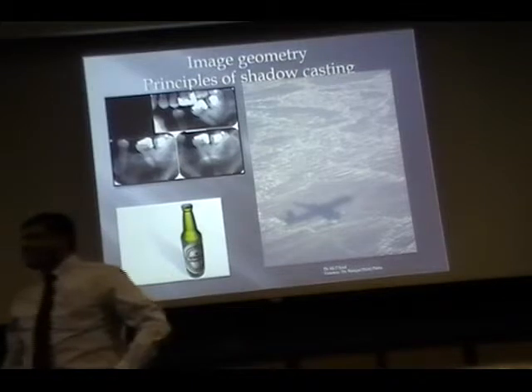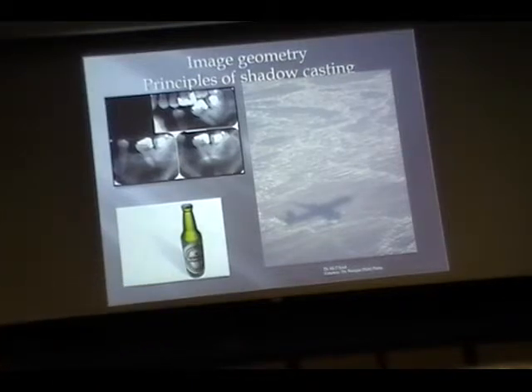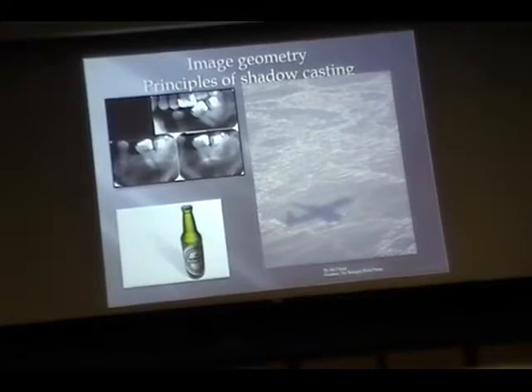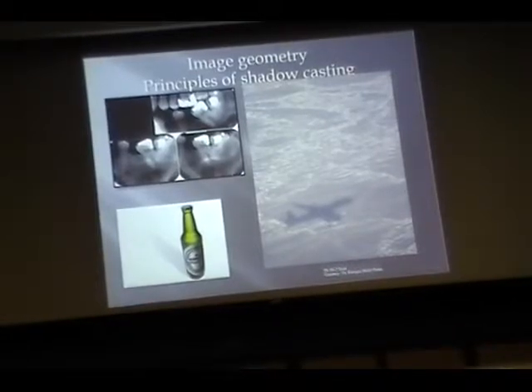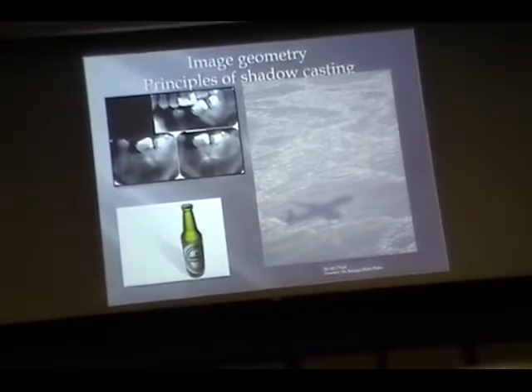You know what you used to say the MRI? No, that's not my question. The white is the high signal intensity. Very good. Where do you see that high signal intensity, in T1 or T2?